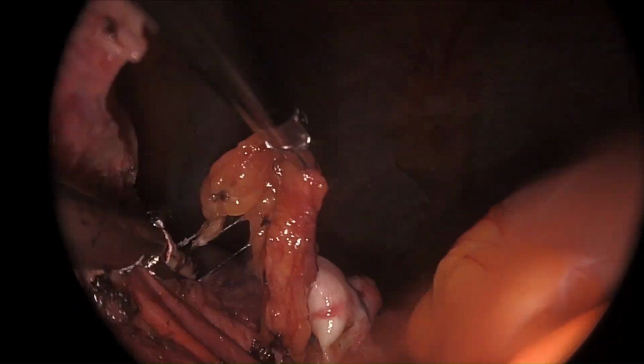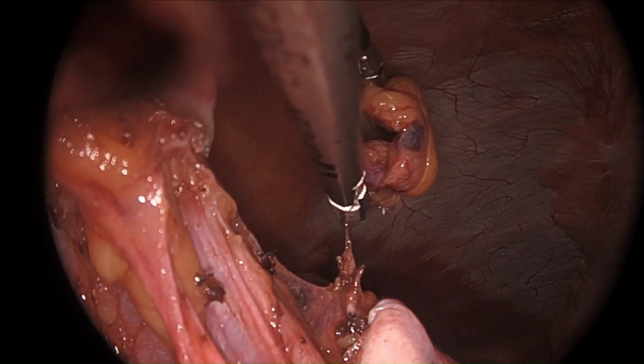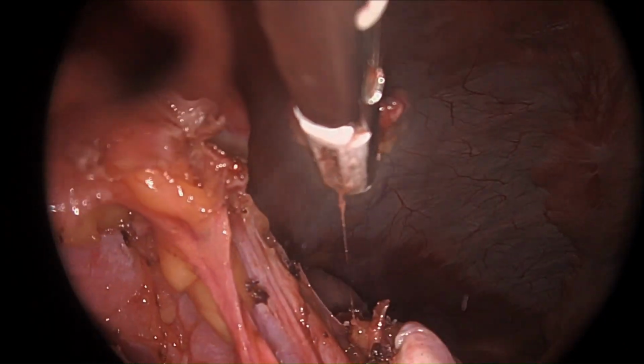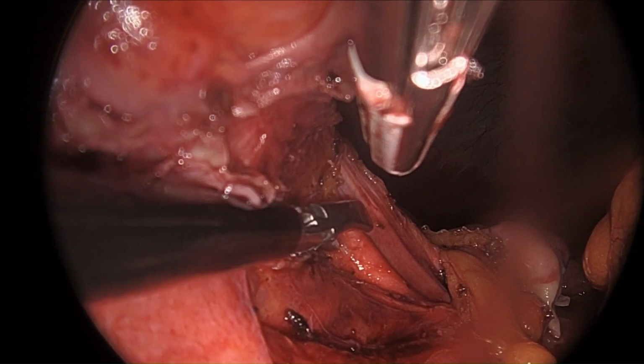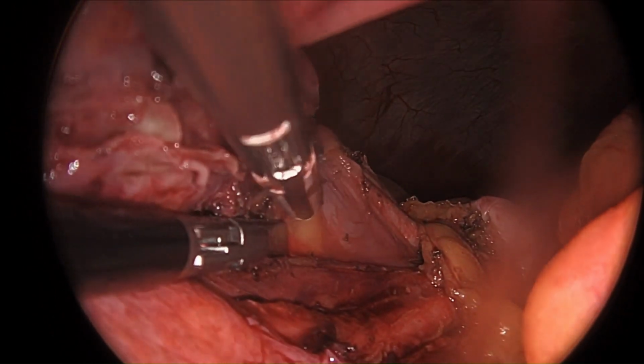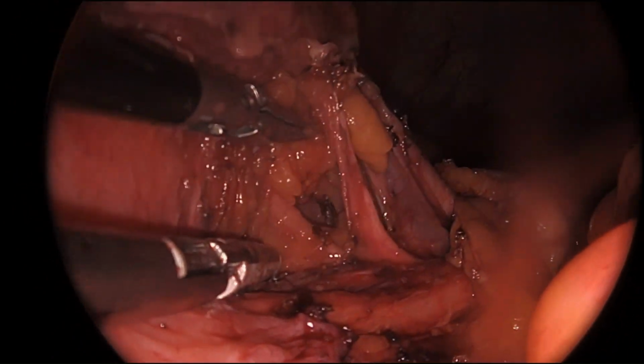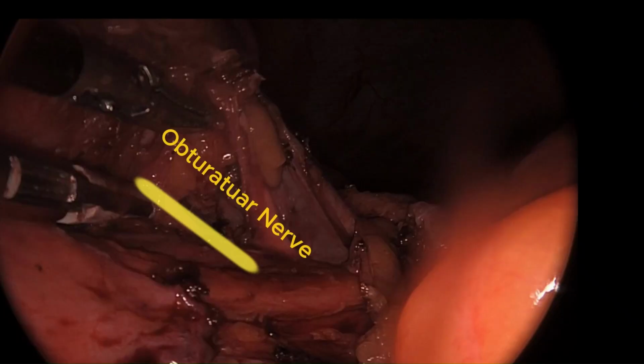After dissection of the major anatomical structures, harvesting of the lymph nodes was started. To harvest the obturator lymph nodes, the obliterated umbilical artery was grasped. The obturator nerve was exposed by dissection under the external iliac vein, and a right obturator lymphadenectomy was performed.